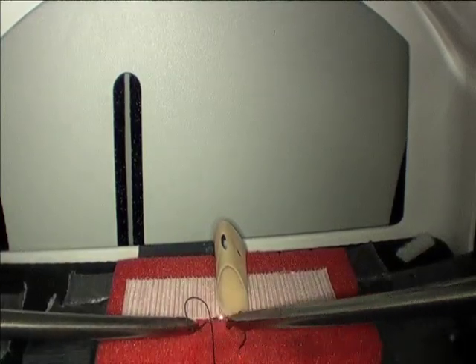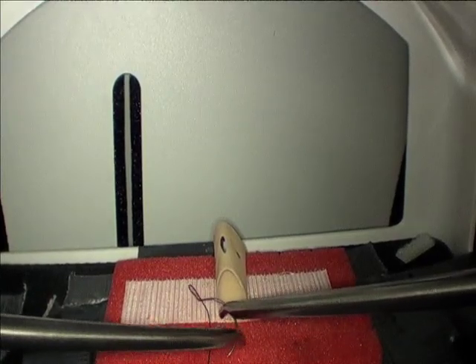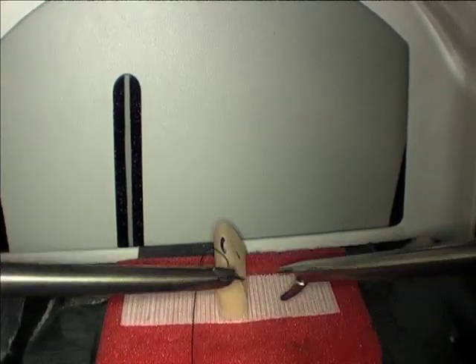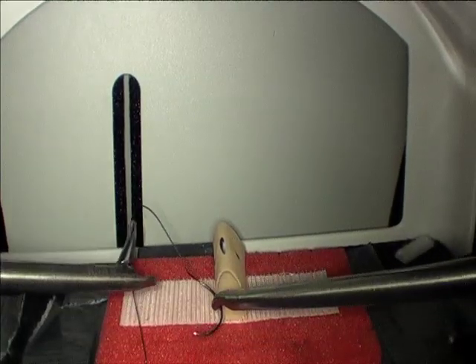A lot of people struggle loading the needle into their needle driver, placing it onto the tissue, fumbling with two hands trying to load it in the proper orientation. This takes time and is inefficient.